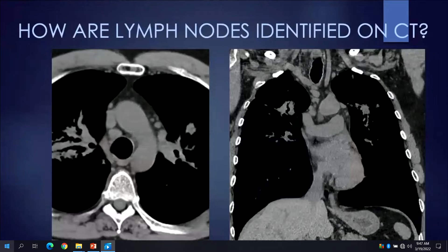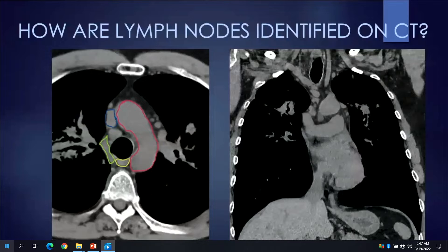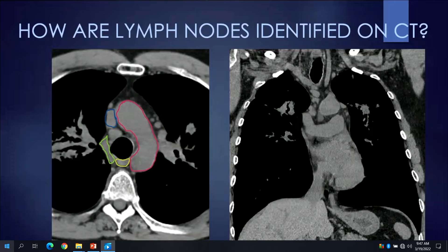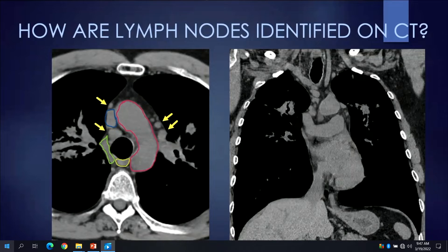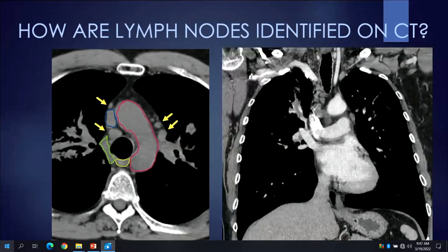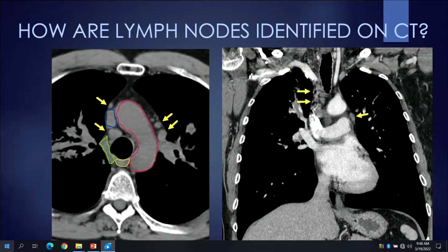How are lymph nodes identified on CT? Based upon our knowledge of normal anatomy, we can identify the normal anatomic structures — here I've outlined in red the aortic arch, in blue the SVC, in green the azygous vein, and in yellow the esophagus. All remaining unidentified soft tissue structures in the mediastinum are lymph nodes. On the coronal reformatted image, we could go through the same anatomical exercise, or administer intravenous contrast, which opacifies the cardiovascular structures and renders the soft tissue structures in the mediastinum — which are lymph nodes — much more conspicuous.